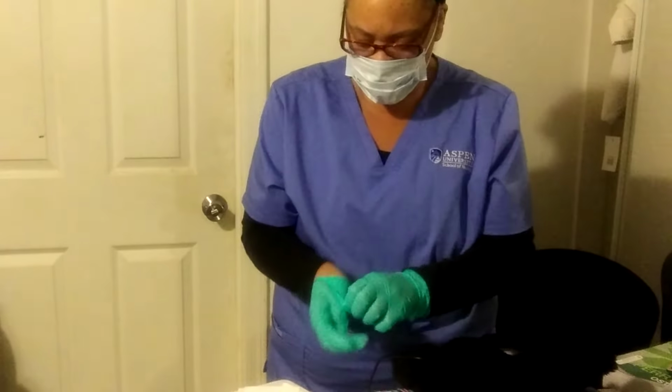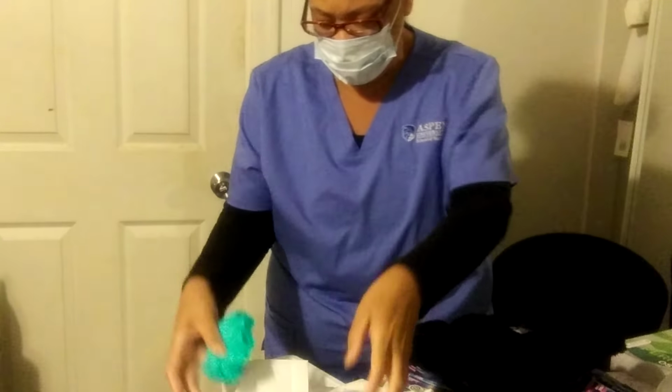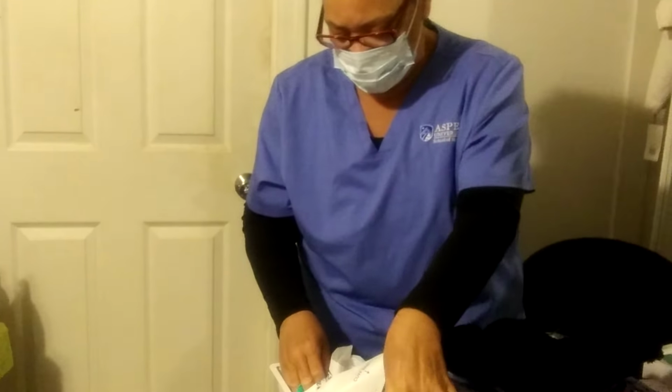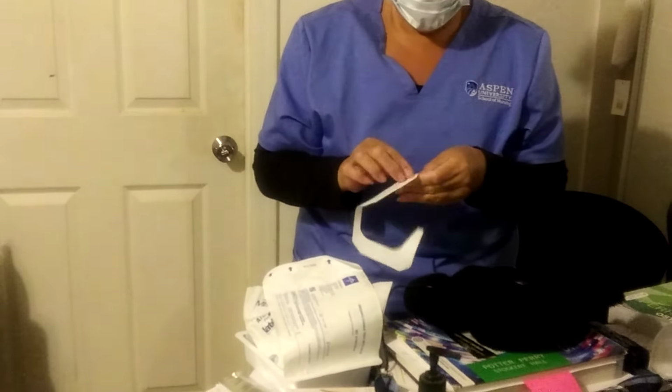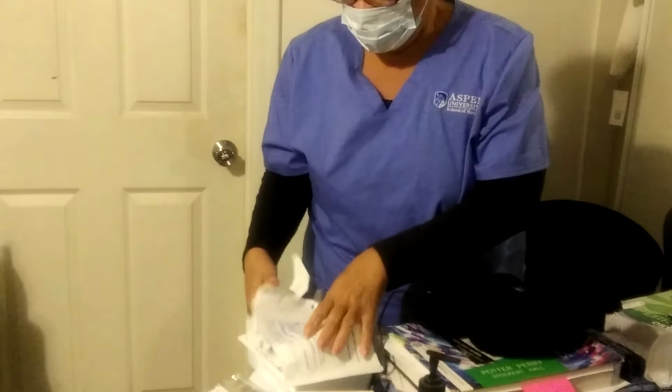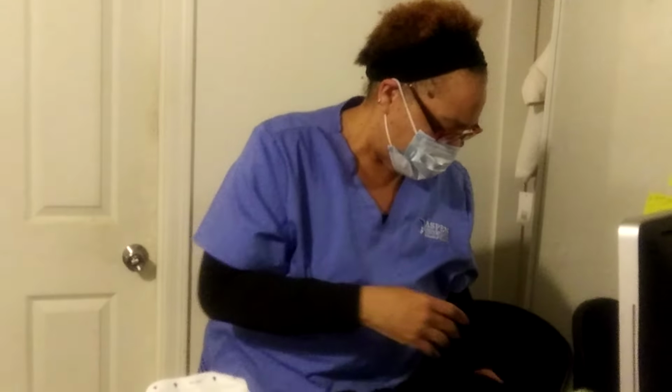Okay, now that procedure is done, I take all my belongings, pick up my gloves, pick everything up in my kit. And then I take my kit, throw it away, wash my hands again, and I get my pen.